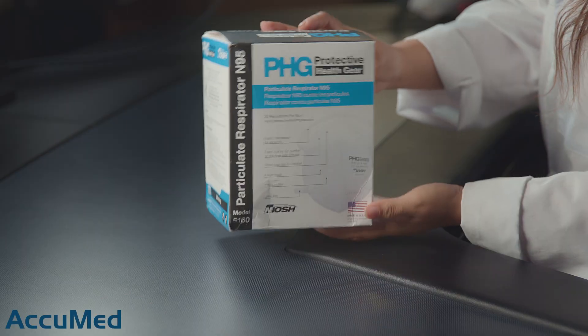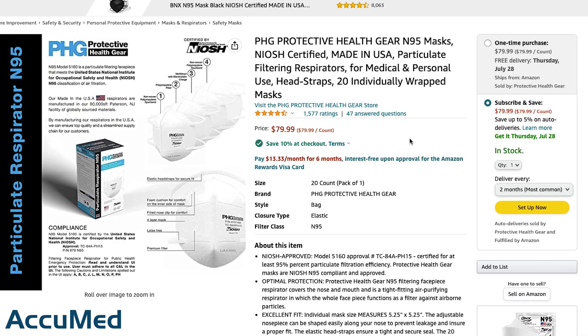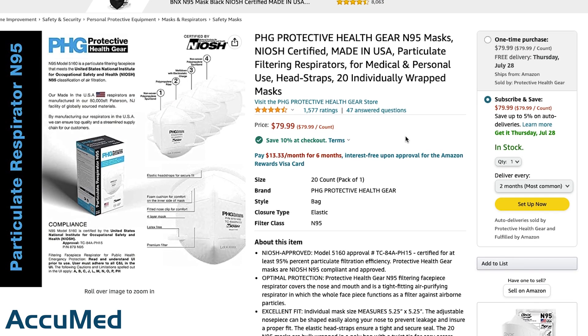Hello everyone and welcome back to the AccuMed channel. Today we're going to be reviewing the PHG N95 respirator. We purchased these from Amazon and this is the listing.